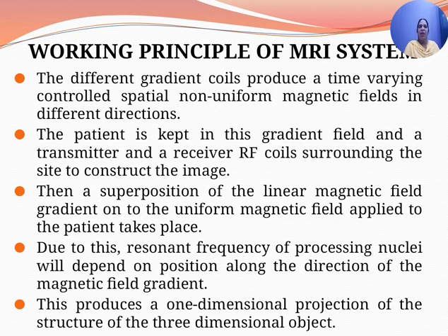These are different coils designed for different anatomical regions. The three basic types are the body, the head, and the surface coils. MRI uses RF signals to transmit the image from the patient's body. The RF energy used is a form of non-ionizing radiation. The RF pulses applied to the patient's body are absorbed by the tissues and converted to heat. A small amount of energy is emitted by the body as signals and is used to produce an image.